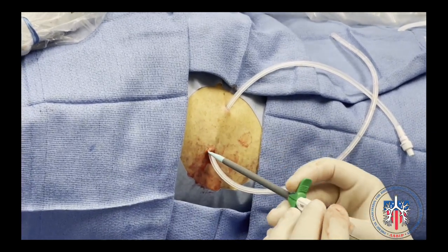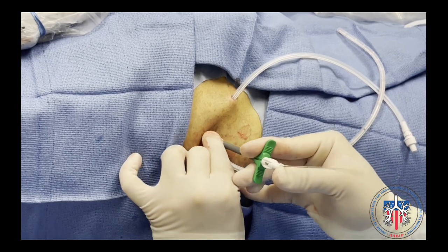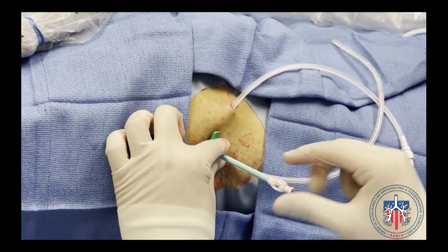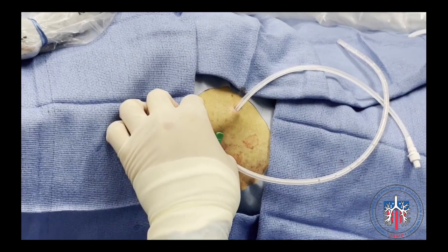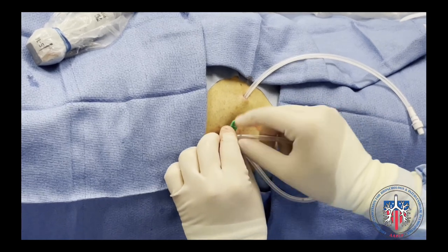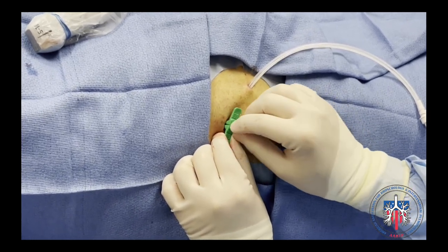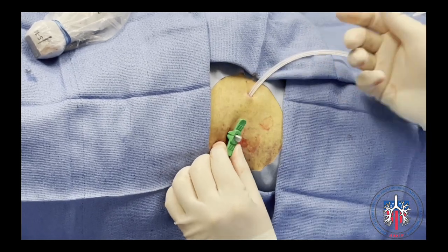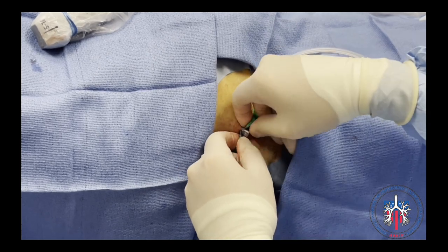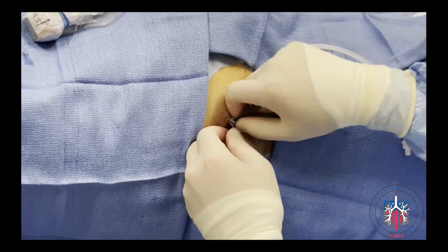The peel-away introducer is then inserted over the guide wire, positioned coaxially with the guide wire, and advanced into the pleural space. Once the introducer has passed the parietal pleura, the peel-away sheath is advanced over the introducer all the way into the pleural space. As the guide wire and introducer are removed, leaving the peel-away sheath in position, a finger is used to cover the peel-away sheath so that pleural fluid does not leak through. The finger is removed and the fenestrated end of the pleural catheter is inserted through the peel-away sheath. Once the pleural catheter is inserted all the way, the peel-away sheath is snapped in half and peeled proximally. From time to time, the pleural catheter may need to be advanced further as the sheath is being peeled back. This process is continued until the peel-away sheath is removed entirely.